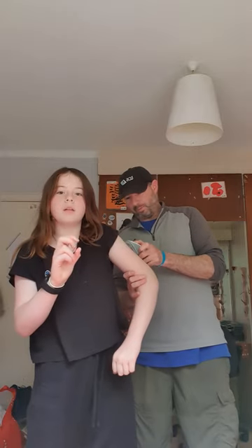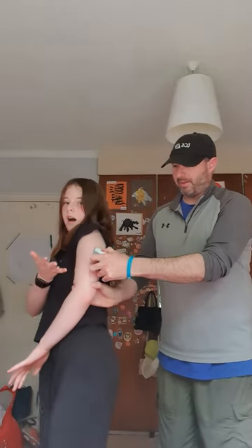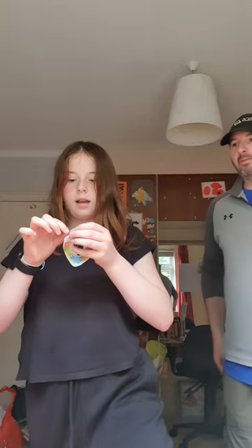Three, two, one. It may hurt a little bit but take a deep breath. Now once you take it off you get this and put it in your arm — click, clack, you should hear that. It's really easy. Then you will get your patch if you want it, peel it up, and just press it around the sensor. And done.